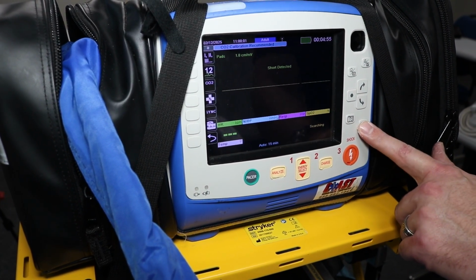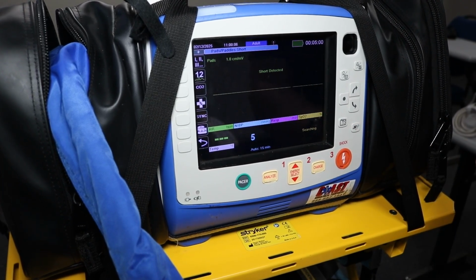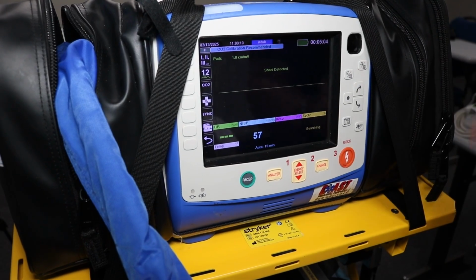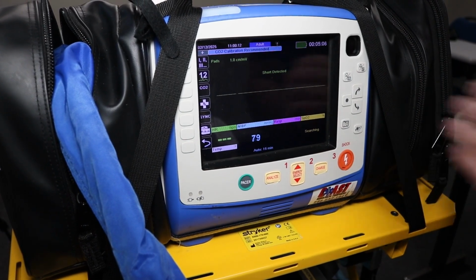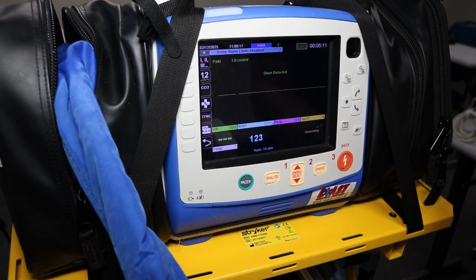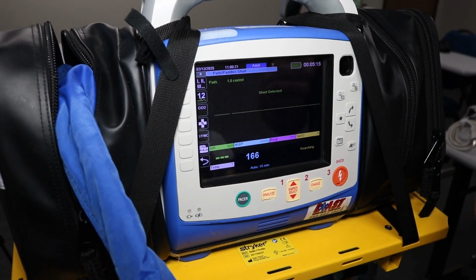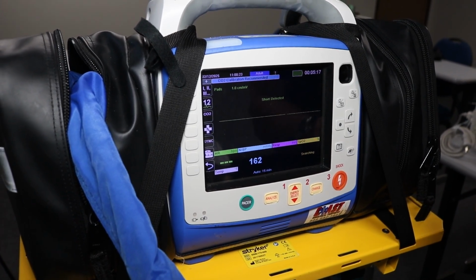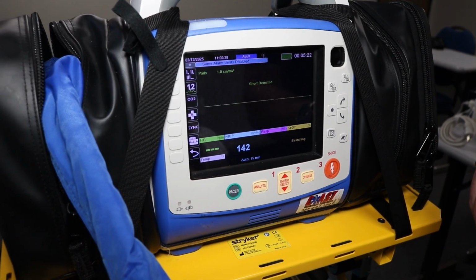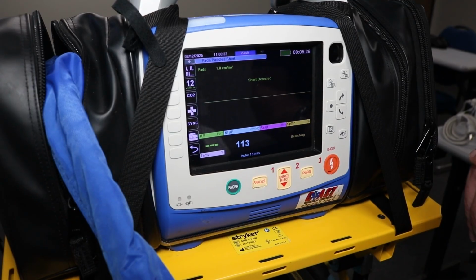Now I will get my first blood pressure cuff by hitting the stat BP. It will go up. After it reads that patient's blood pressure, it will take a vital sign or a blood pressure every 15 minutes from that point on. If your nurse wants the blood pressure to be taken more often, Q10 minutes or Q5 minutes, you would just do the same thing, but change your interval to whatever setting the nurse would like.